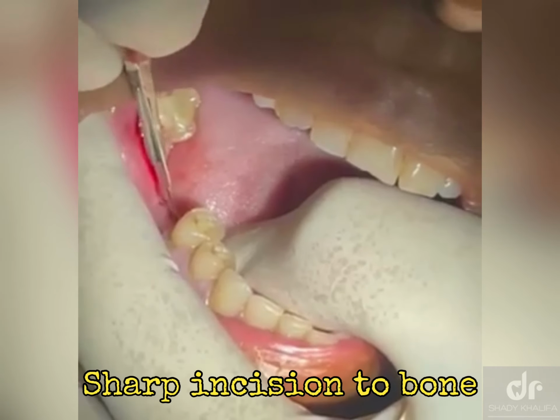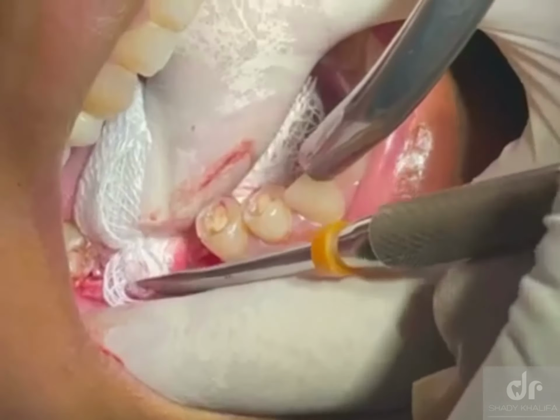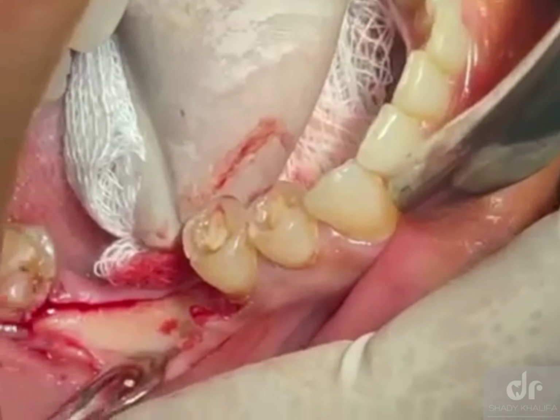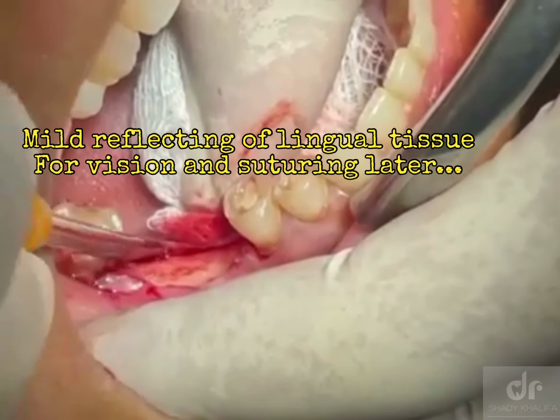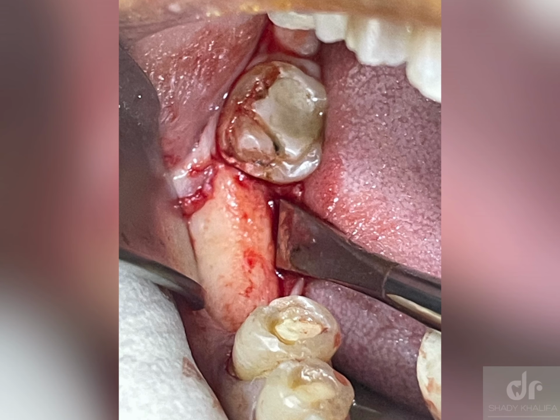A hard one-step incision should be taken, and the goal is to make the reflection easy without slippage of the periosteum. Also free a little bit of the lingual tissue to make suturing easier.